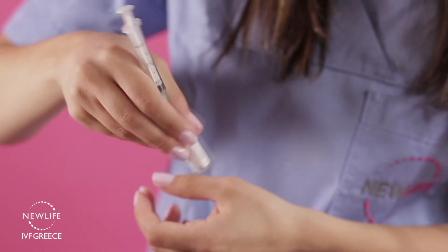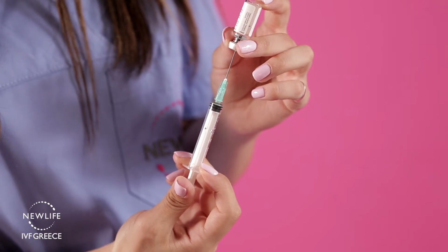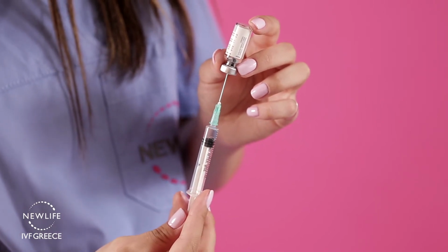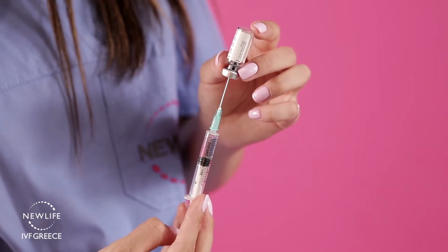with your hand. After the powder is fully dissolved, pull back the plunger, filling the syringe with the total contents of the vial. Any residual fluid is removed by turning the vial upside down, moving the syringe further down, and pulling again the plunger backwards.